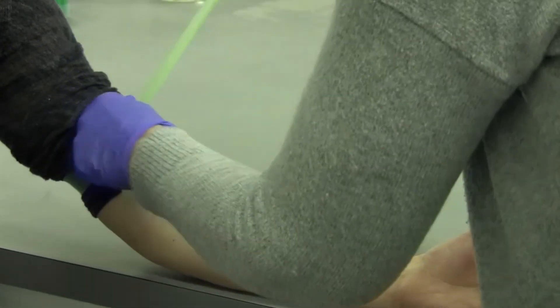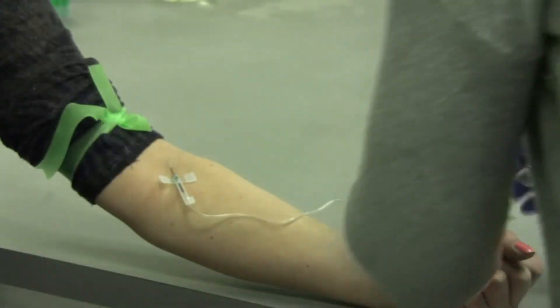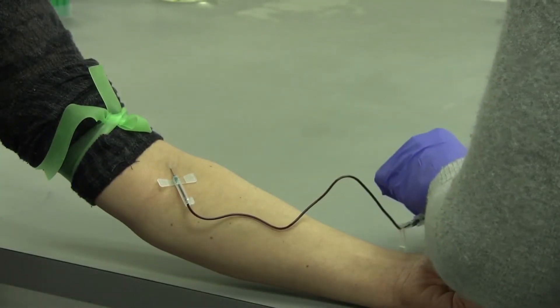Before drawing the blood sample, it is important for your practitioner or phlebotomist to read the draw and shipping instructions. They will use the serum separator tube to collect the blood.